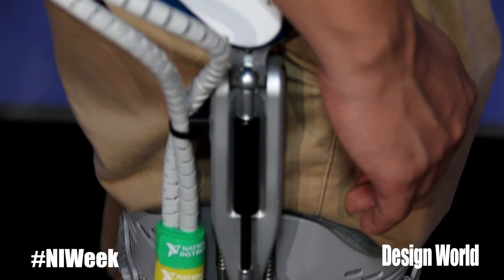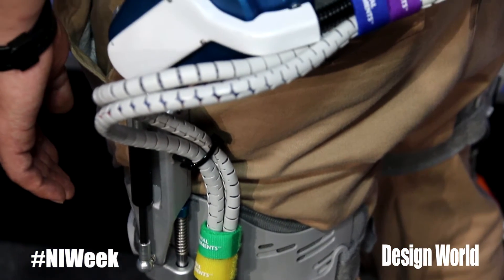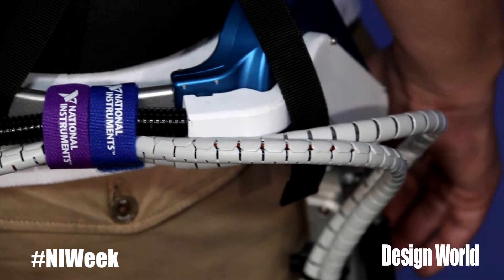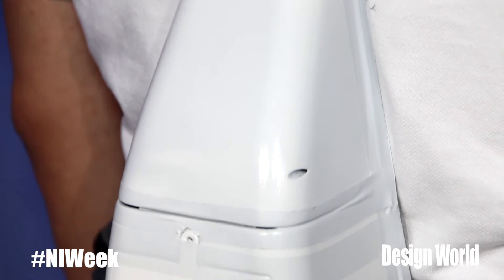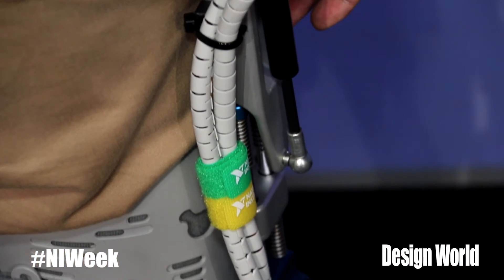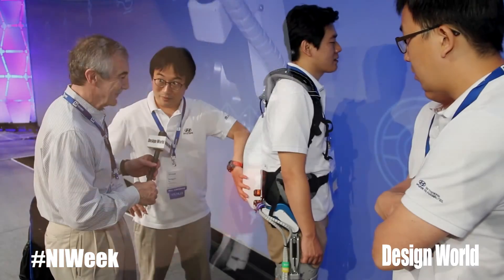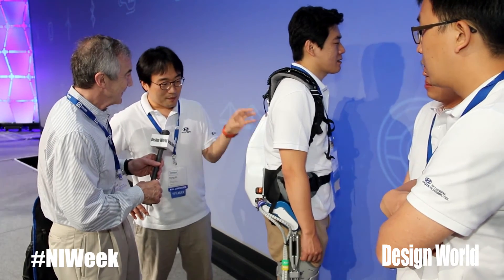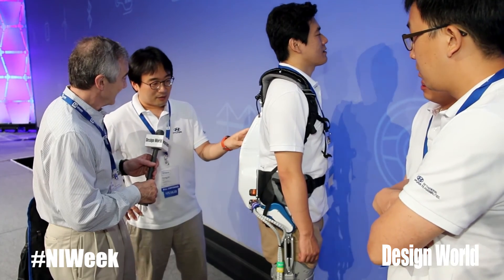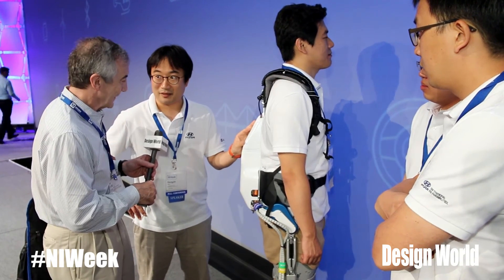There are electronic packs on his back — can you show those? What are the connections we see here? All the power is applied through these lines, and this pack contains a motor driver, controller, battery, battery regulator, and battery management system. This whole pack is really compact, so it's very challenging to fit all the devices into this small volume. We try to minimize the battery pack, motor driver, and every other device. Compactness is very important for this kind of exoskeleton.